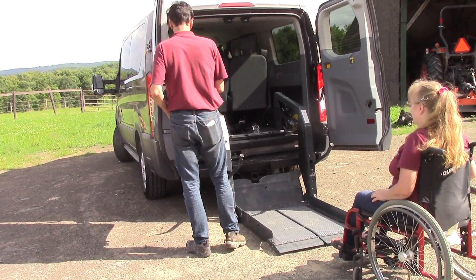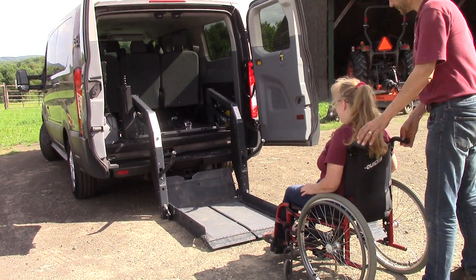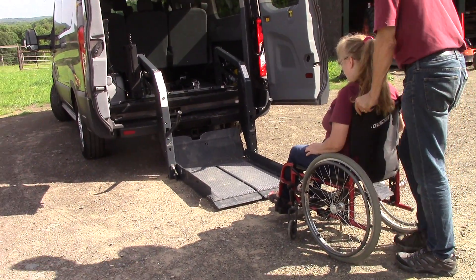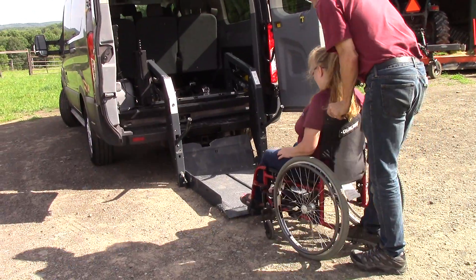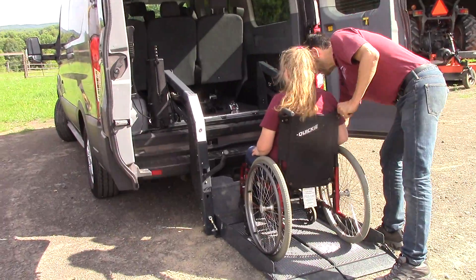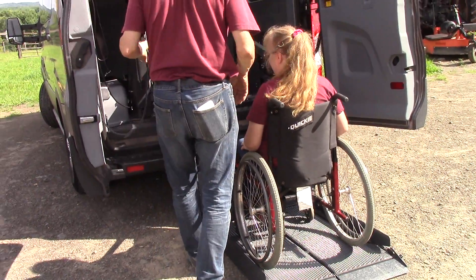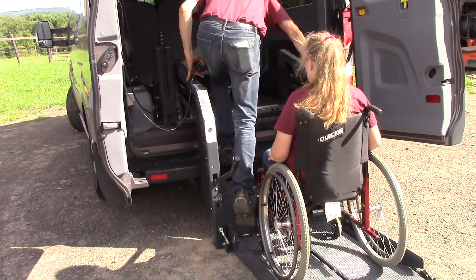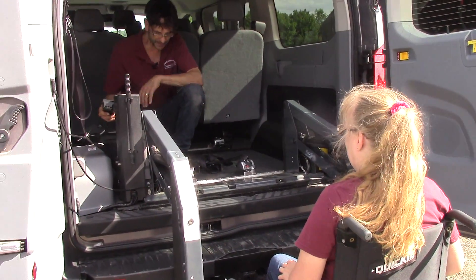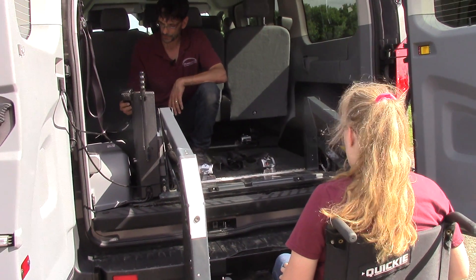Because we're going to have to do the front tie-downs, we're actually going to have to put the user on the wheelchair and then the assistant is going to go inside and precede the user. We're going to lock in place here, but now I've got to go in ahead of the user. Now that sound you hear there is the safety beam. So we're going to go up.